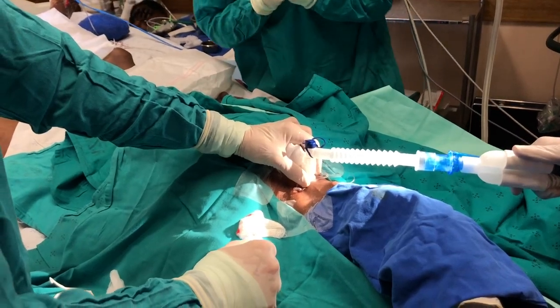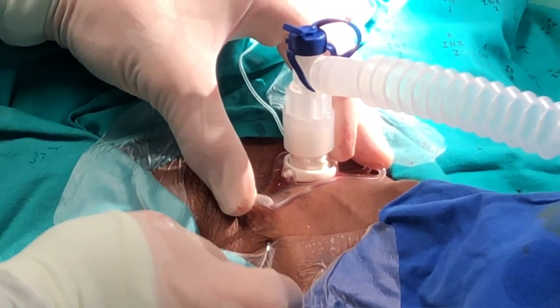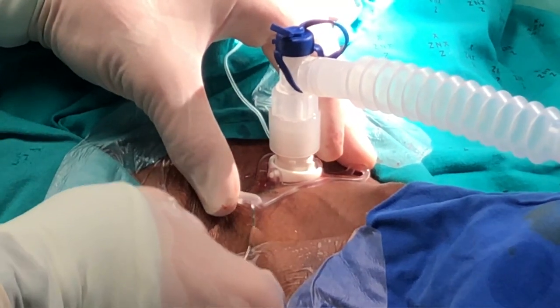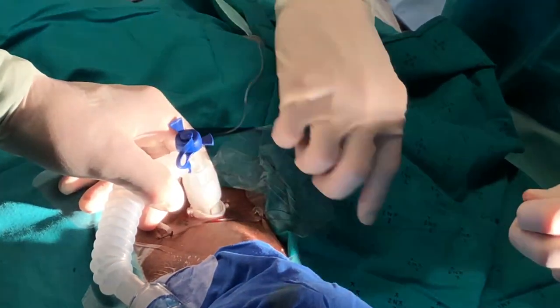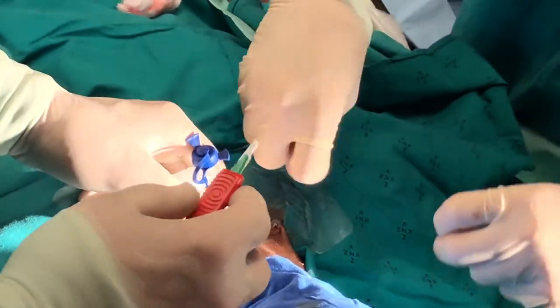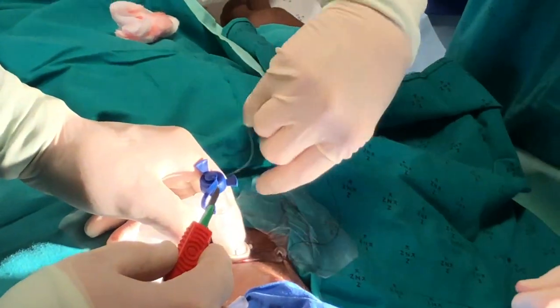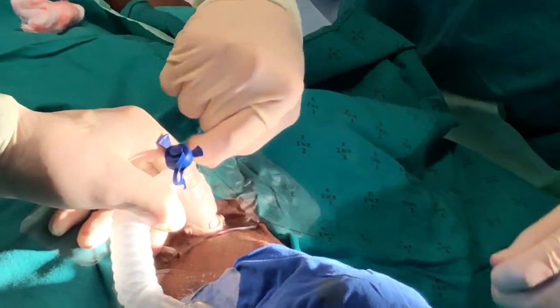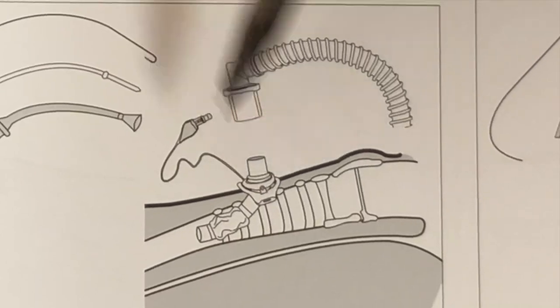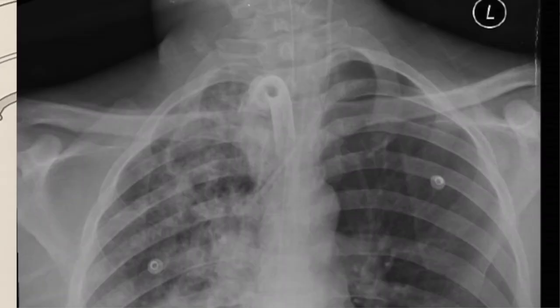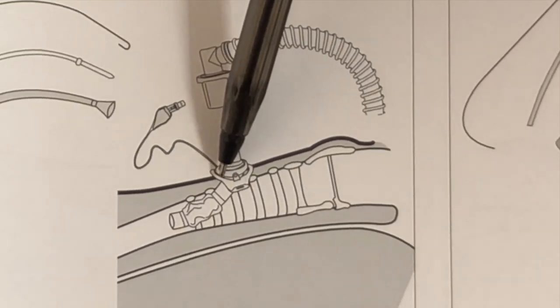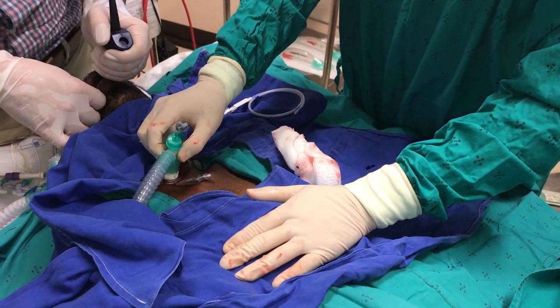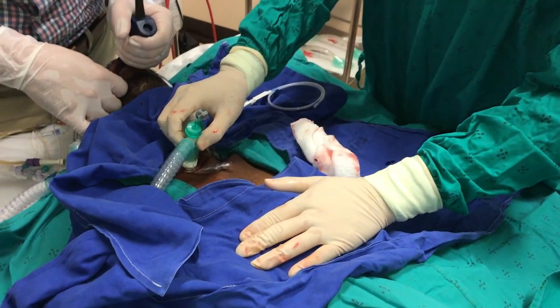Finally, to obtain hemostasis, it's my practice to suture the tracheostomy tube in situ with four nylon sutures that are meant to hold this device immobile for 24 hours to secure hemostasis. After 24 hours they can be removed and conventional tracheostomy tapes can be applied. At the end of the procedure you should have a sited tracheostomy tube with inner tube. Any small blood vessels should be constricted by the physical presence of the device, and conventional tracheostomy management now follows.